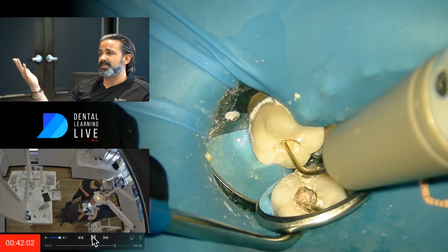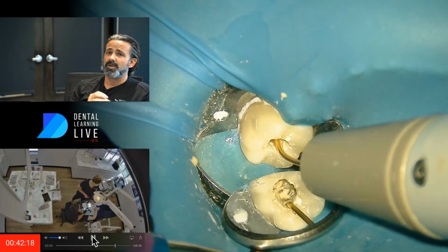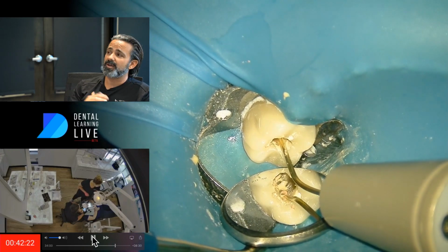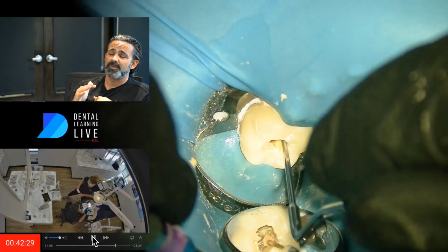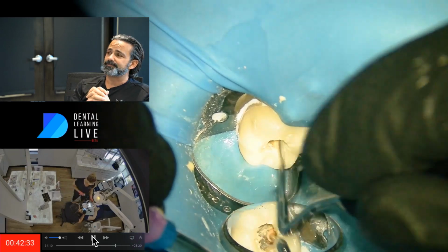Those would be my decision trees that you have as a doctor, and I have as a doctor. Being a doctor, that's what I have to do. So in this, for instance, I used length to solve that pull when I pulled that cone out, and then just put in a bigger cone. It matched up. I'm confident with it, and I went forward with it. That was the decision I made. And so now I'm just down packing the top.